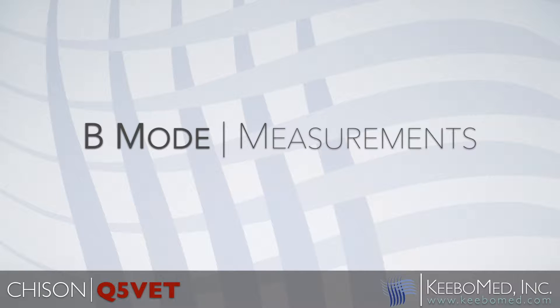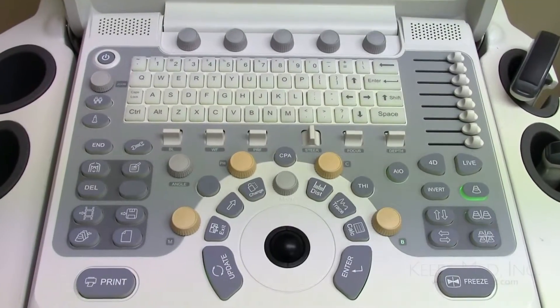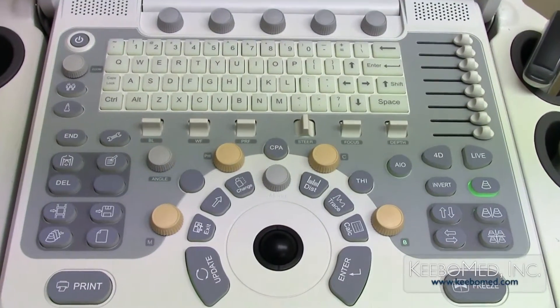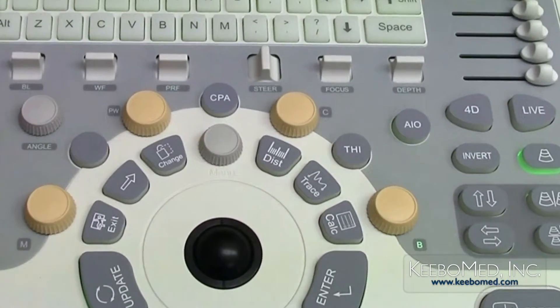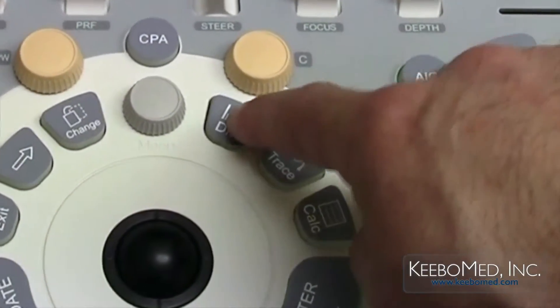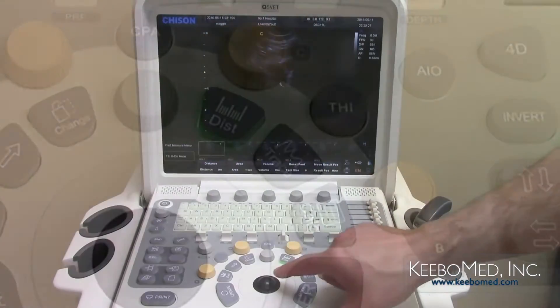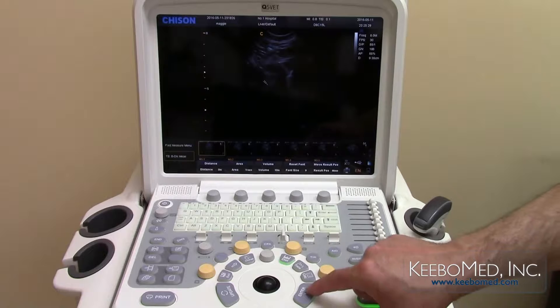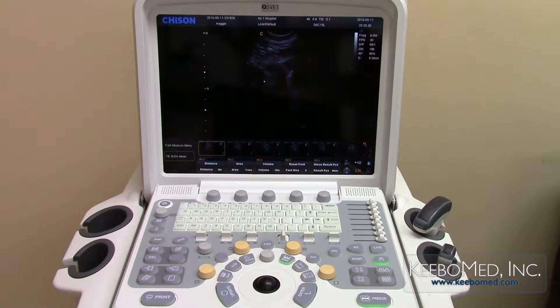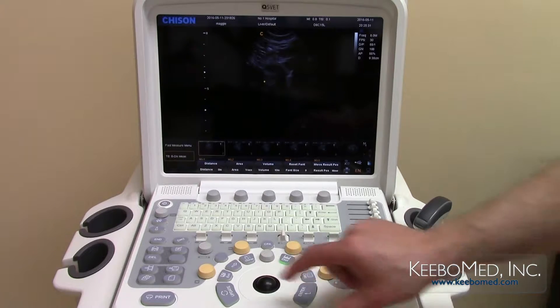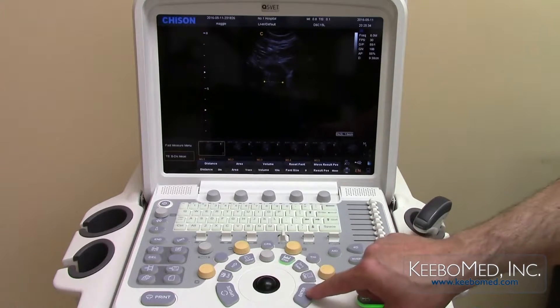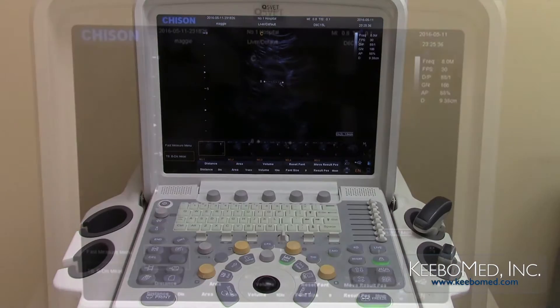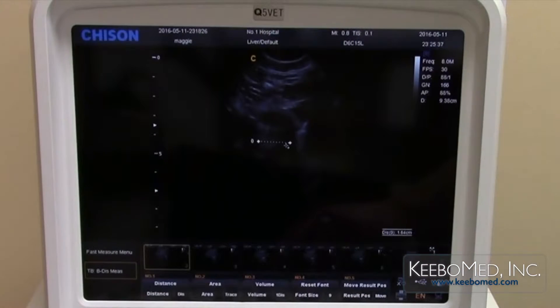There are three measurement buttons: distance, trace, and calculation. Distance measures the distance between two points. Press enter to select the starting point, then move the trackball to the end point and press enter again to confirm.